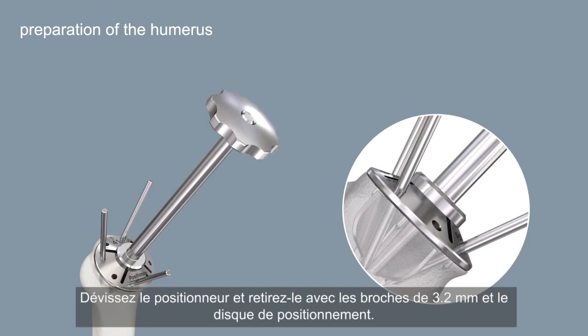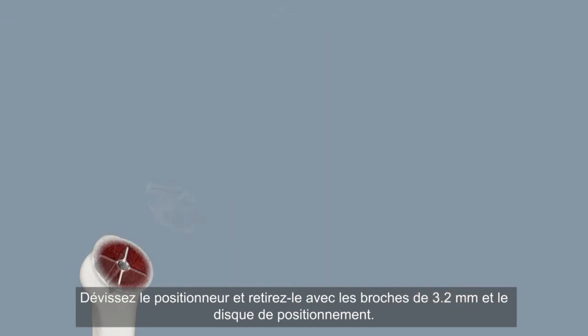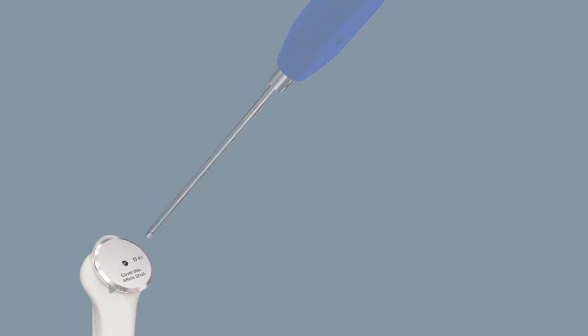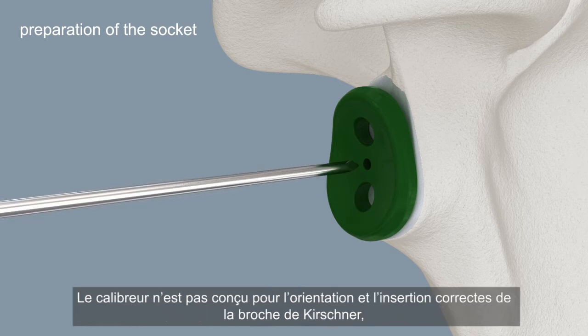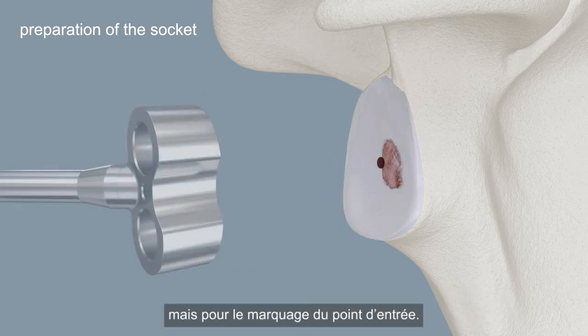Unscrew the positioner and remove it together with the 3.2 millimeter pins and the positioning disc. Use an appropriately sized cover disc to protect the resection surface of the humerus. The size of the implant can be determined using the templates. The template is intended not for the correct orientation and insertion of the Kirschner wire, but for marking the entry point.